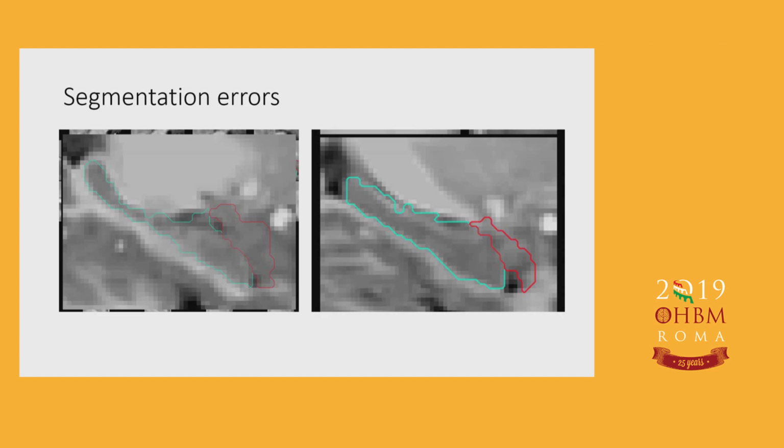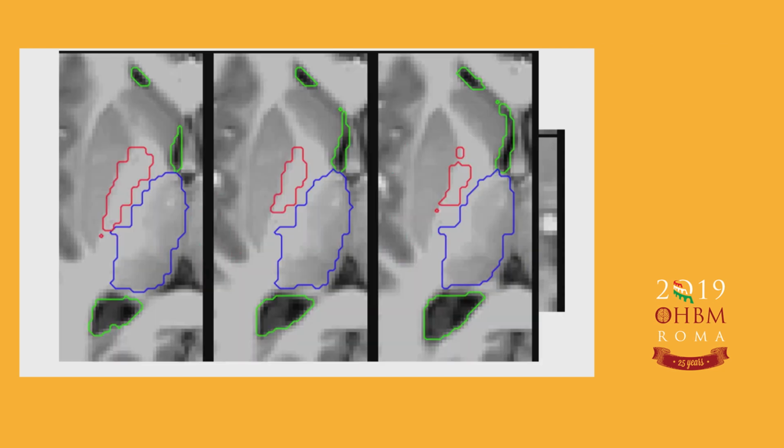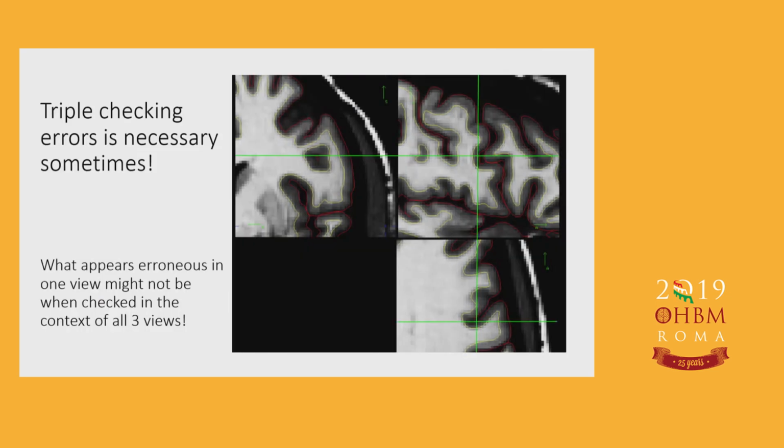Can you see it? It's overestimated. It's actually very badly wrong, even on the right too. And these are more examples for subcortical volumes. In this case, for example, I think these two areas are erroneous, right? And even for lateral ventricles, which are often quite easy to segment, there are issues with FreeSurfer due to many reasons. So you need to visually review them for accuracy before any important analyses.